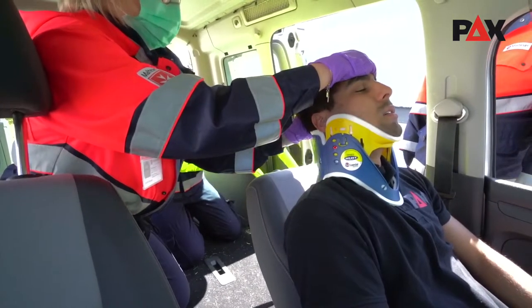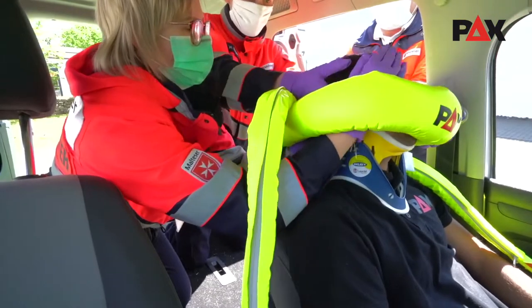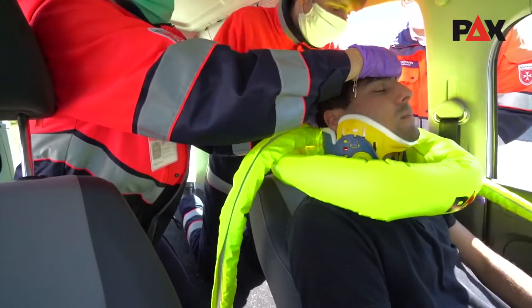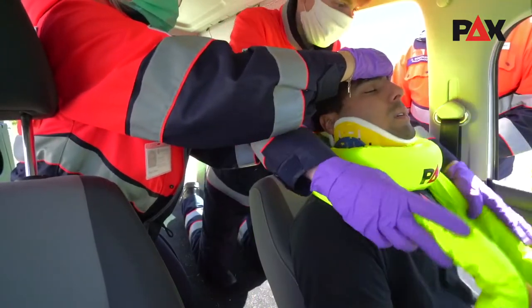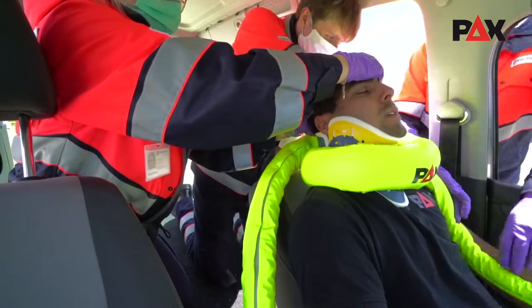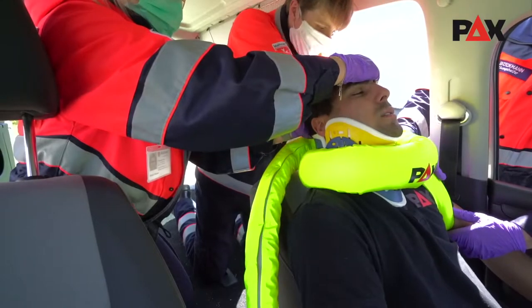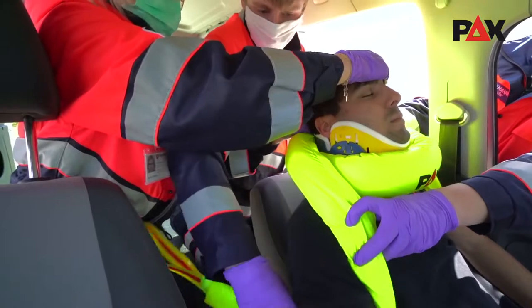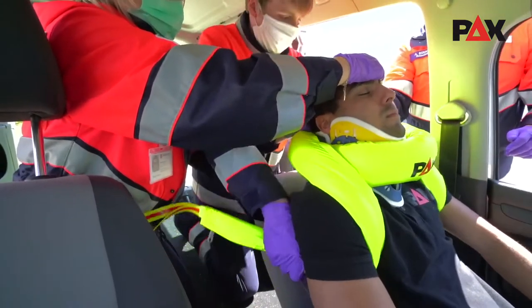The second scenario shows the rescue of the patient via the rear of the vehicle. This is necessary, for example, if the two front doors cannot be opened. Because this vehicle has a large headroom, the BOA can also be placed as a pre-prepared sling over the patient's head. A continuous fixation of the head should be ensured. A diametric longitudinal tension is exerted and the two ends brought forward are put back under the armpits.